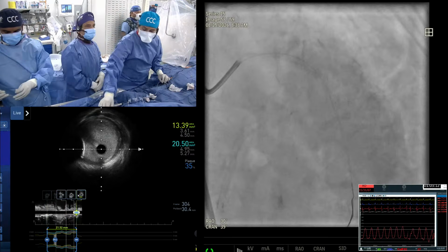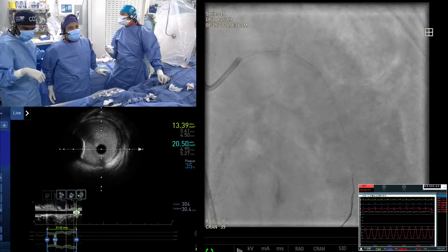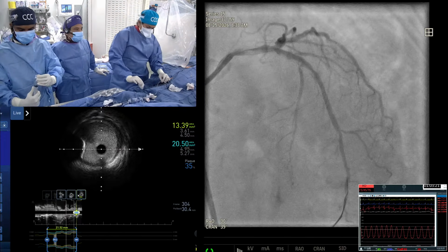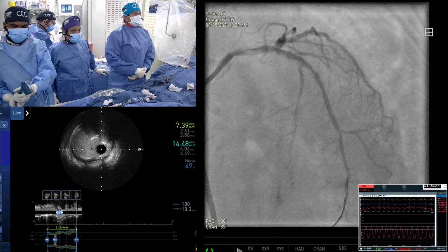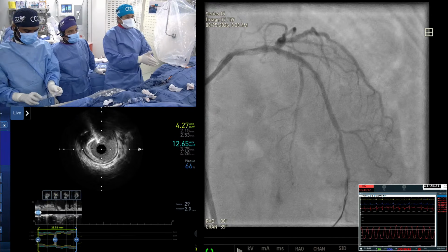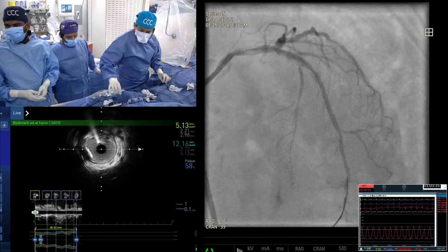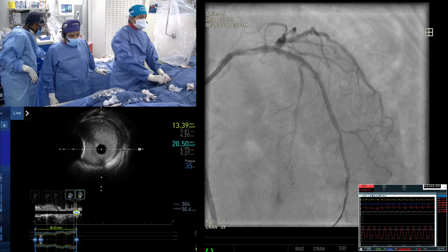Do you think a 3.0 stent is okay for left main? Yeah. So you want to put a 3.5 at low pressure. Okay, 3.5 by 33 at low pressure and a 4.0 at high pressure. Was the mid LAD already dilated with the balloon? It was. We did not go all the way down, but it looks like there is an axial plaque shift. Okay, get the Fielder wire. Let me just wire it.